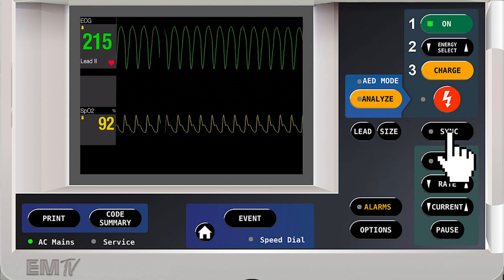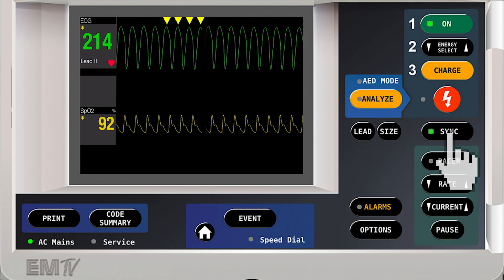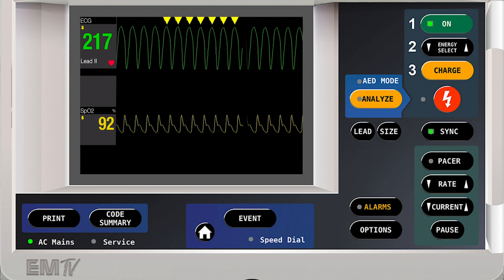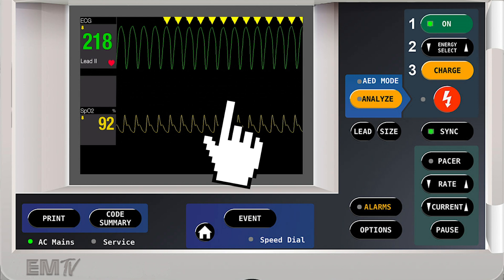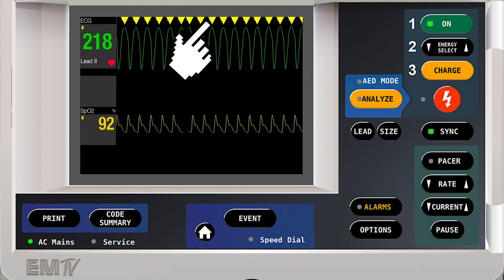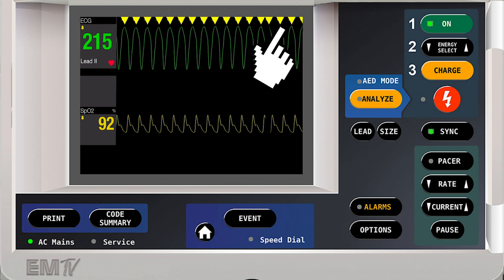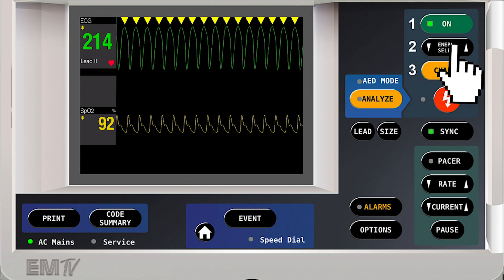Once the sync button is pressed, you'll notice that indicators appear above the R-waves on the ECG rhythm. These indicators denote exactly where energy will be delivered during cardioversion.